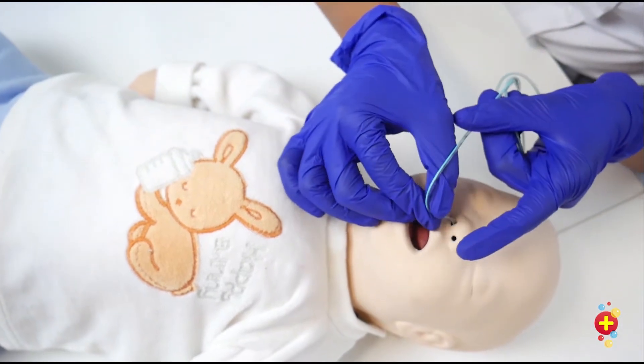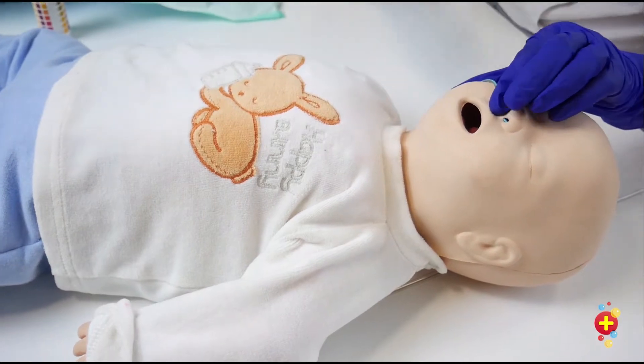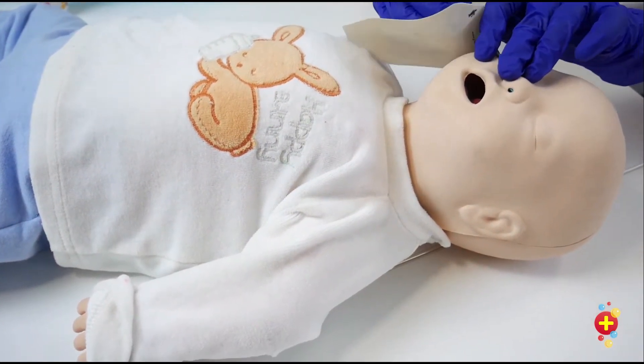When you're at the correct positioning, secure it with a Tegaderm.